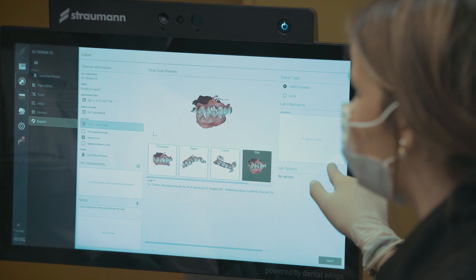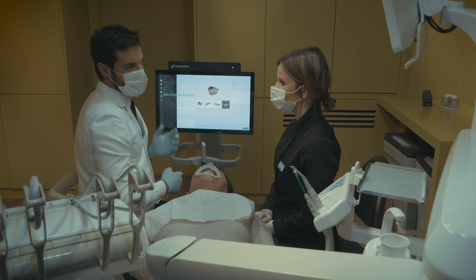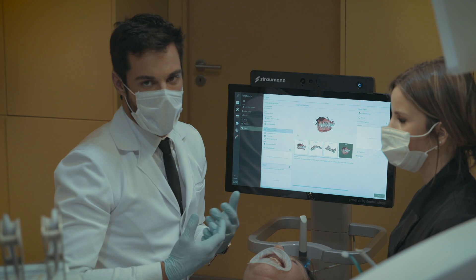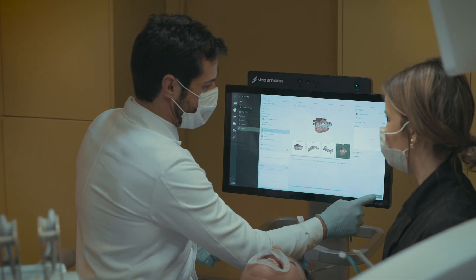You can complete your lab information. And then, if you want, you can add notes and attachments — for example, photographs or any other information you want to include. Then you send it to the lab.